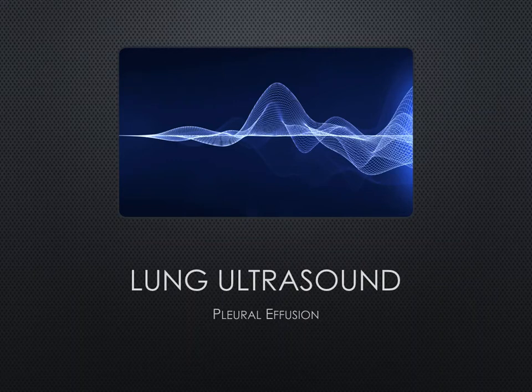Hello and welcome back to this teaching series on lung ultrasound. In this presentation, we're going to be discussing the application of lung ultrasound for investigation of pleural effusions.